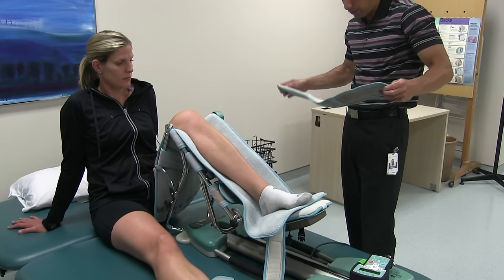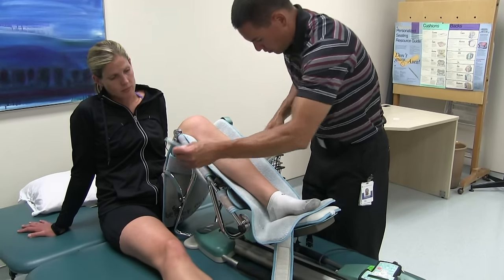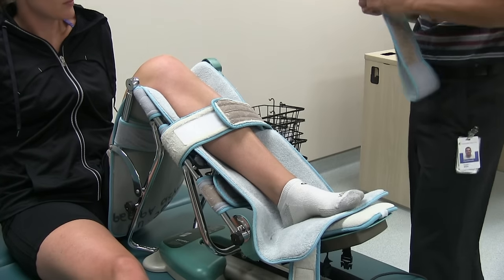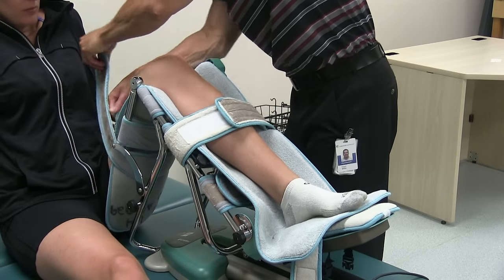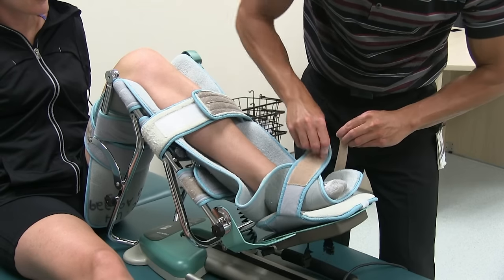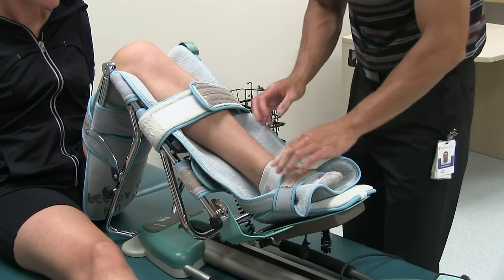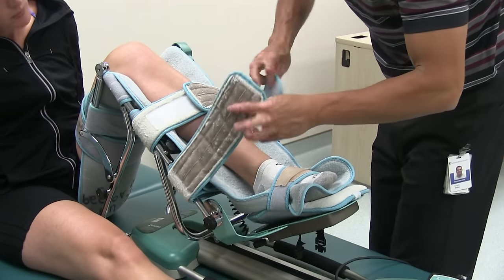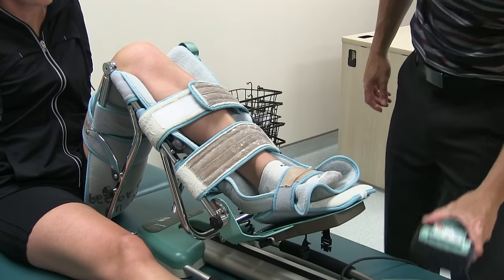We use the straps to lock the leg into place — one around the shin and another on the thigh. There's also a strap built onto the machine for the foot. Depending on the individual's leg length, you may need a third strap around the ankle area, just to make sure the leg stays where it needs to be while the machine is running.